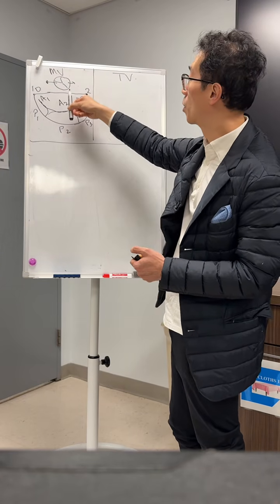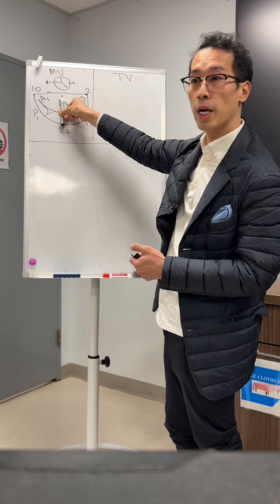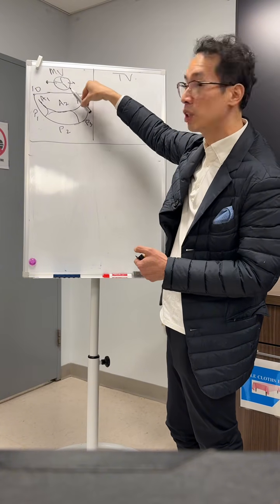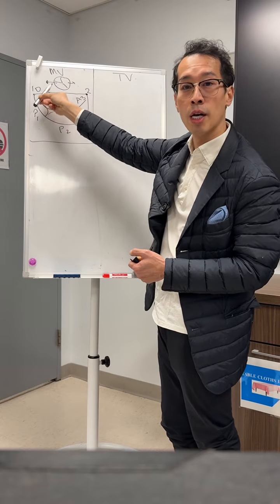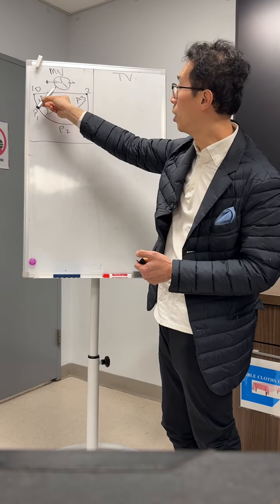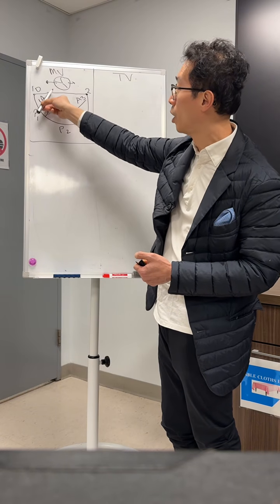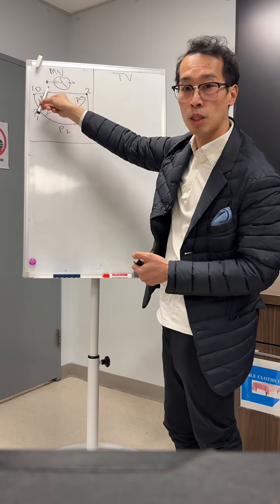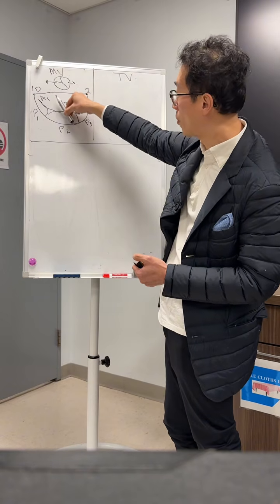So for example, if you're going to grasp A2 and P2, you're going to be in 12 and 6. Okay? If it's going to be more A3, P3, it might be more 11, 5, or even more extreme 10 and 4. And so you basically respect the coaptation line of the mitral valve. Okay, does that make sense? Okay, so if you're A1, the combination would be more like a 2 and 8, or usually maybe 130, 730. So it's very important to respect that coaptation line. And also do not twist the valve. If you clip something like this, that's not good.